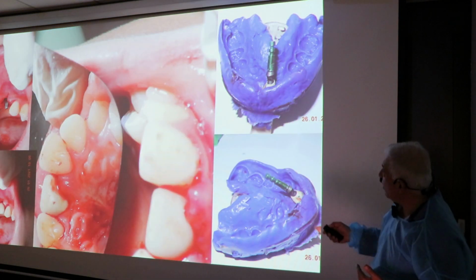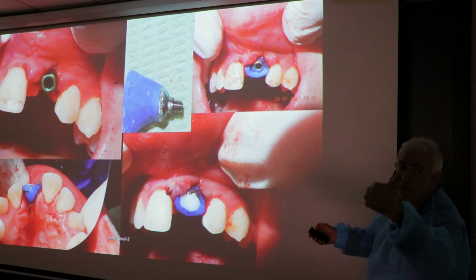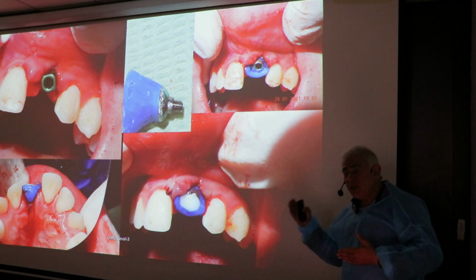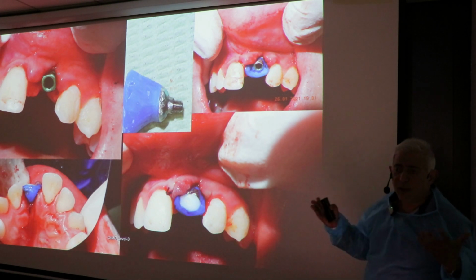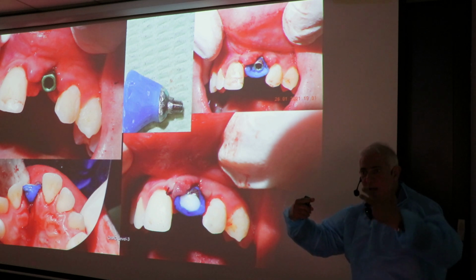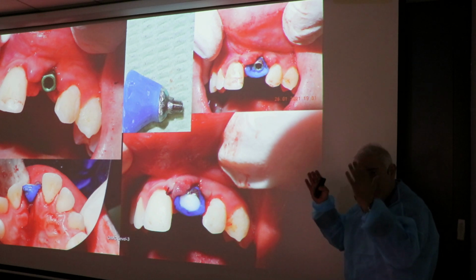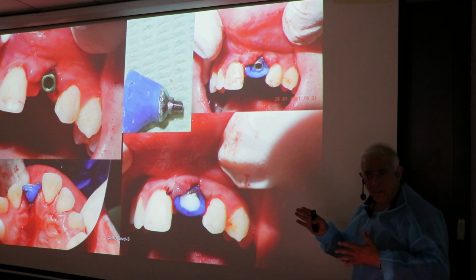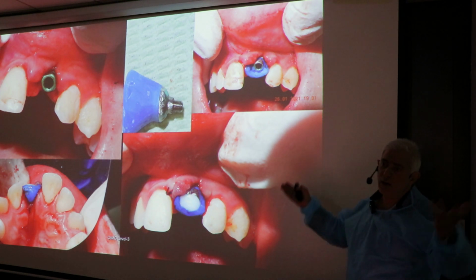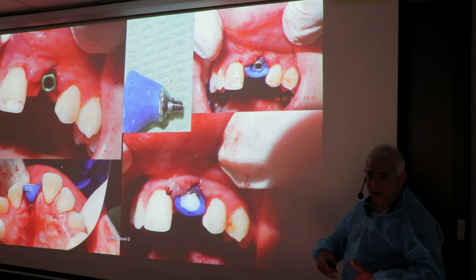He comes, and because we made for him what? A custom made multi-unit abutment, we were now able to only change the crown on top. The reason nobody could help him was because they couldn't go that deep to make an impression. It's angulated. They don't have such a degree. Nobody could think of the solution for this as a multi-unit. And they don't make multi-units for a single tooth. Angulated, they don't make. So instead of saying, okay, they don't make it, go somewhere else, he said, I've been to 8 dentists. They don't know what to do. So we had to find a solution.